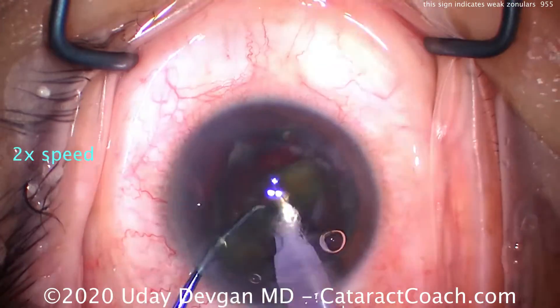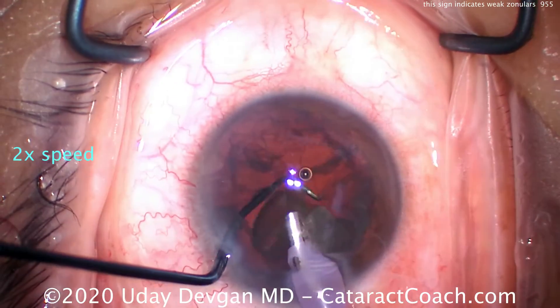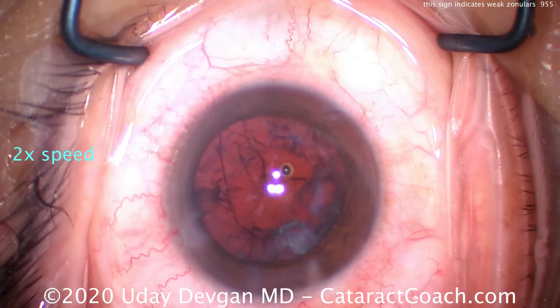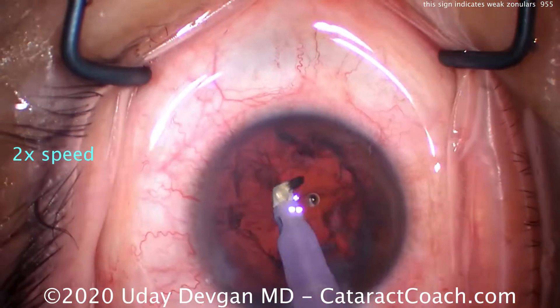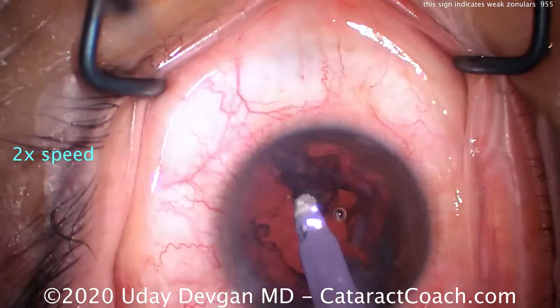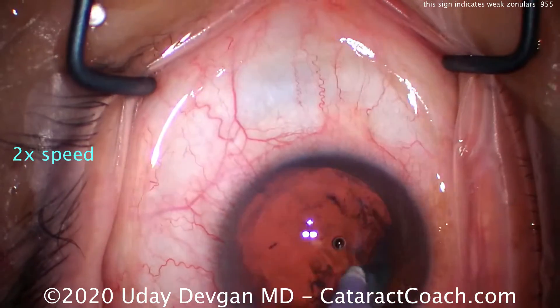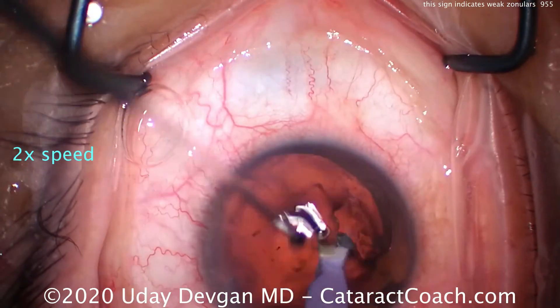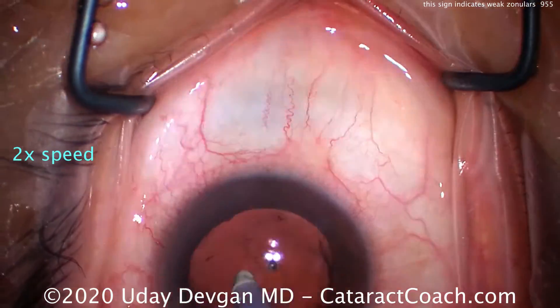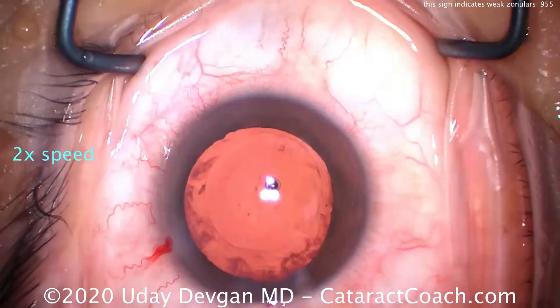Is there a role for a capsular tension ring in this case? I don't know if it'll provide any benefit because the patient doesn't have any focal area of zonular weakness — it's just global. Now cleaning up and time for cortex removal. Watch what happens with the infusion going in — you get that reverse pupillary block, or lens-iris retropulsion syndrome. As we clean up cortex, we're watching the rhexis edge: if the rhexis edge moves during cortex removal, that means very weak zonular support, or you may even be breaking zonules further.